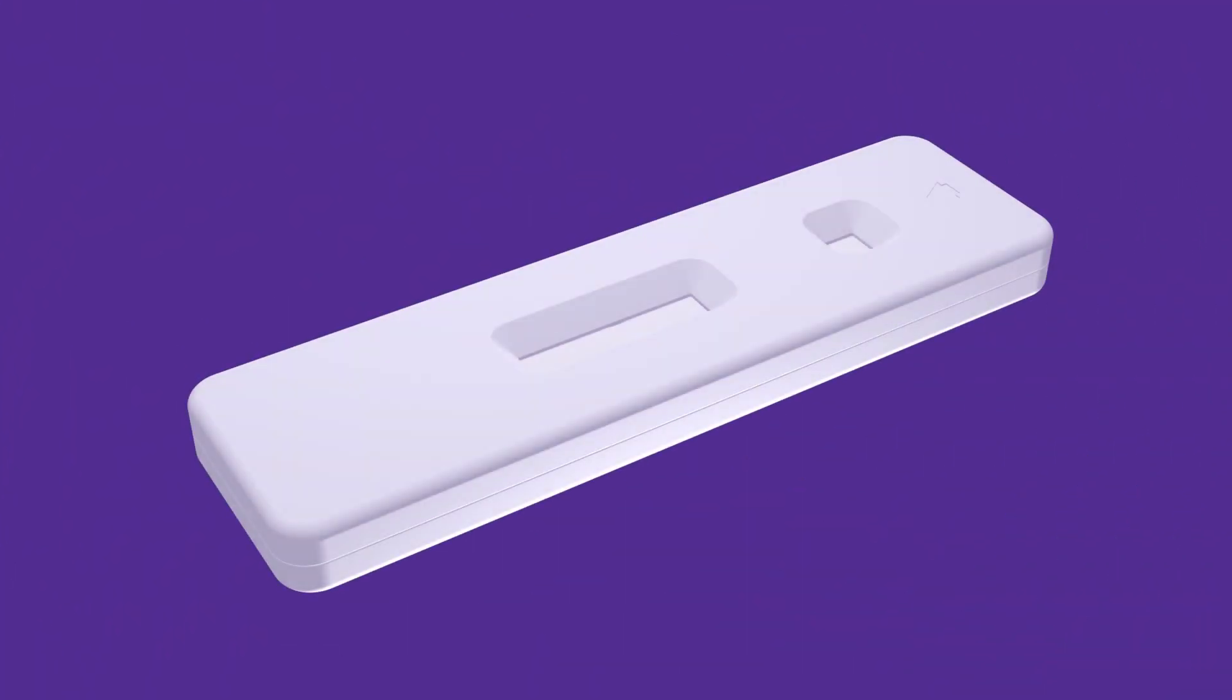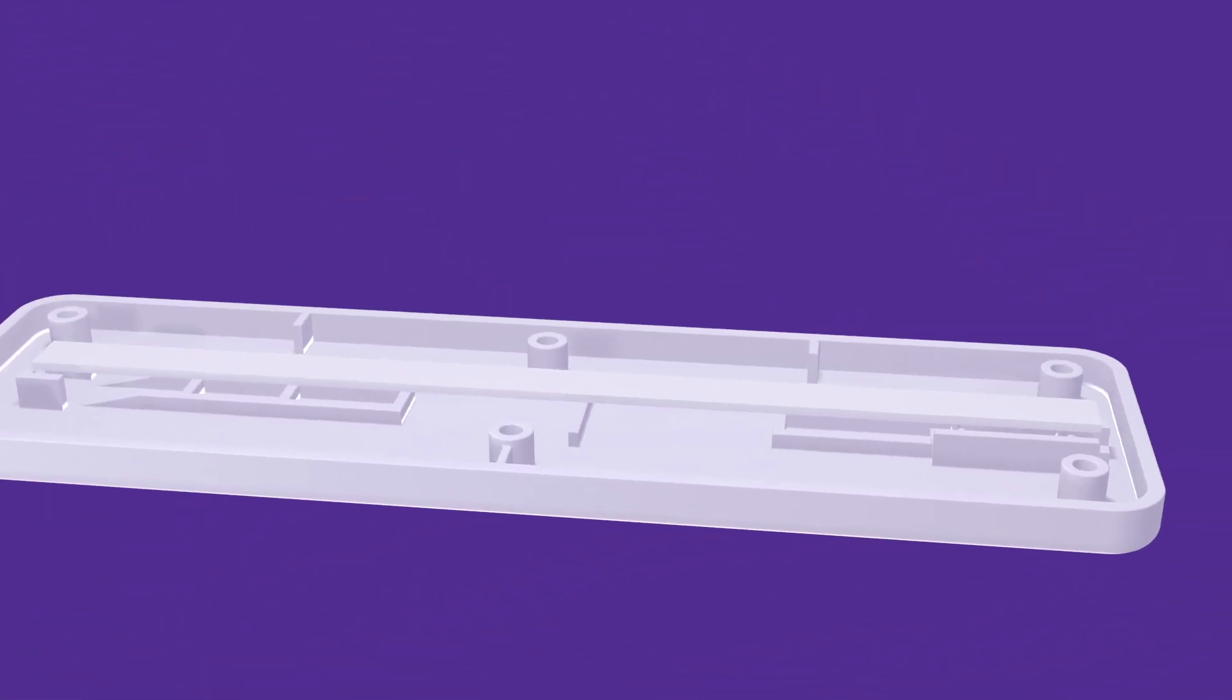Here's how a typical lateral flow test works. A sample, typically obtained by saliva, blood, or urine, is added to the sample pad.